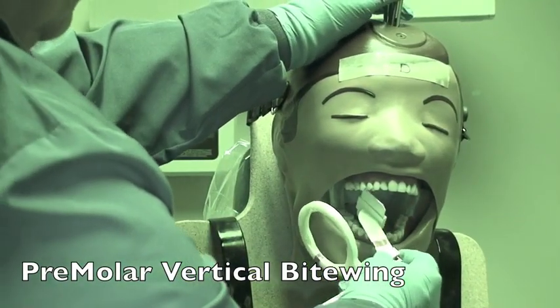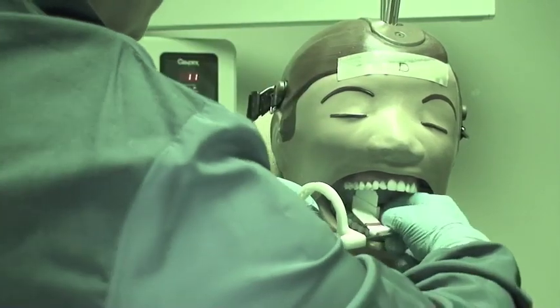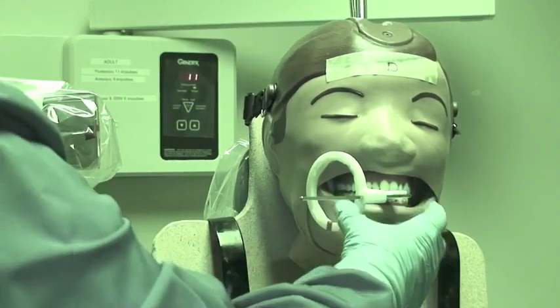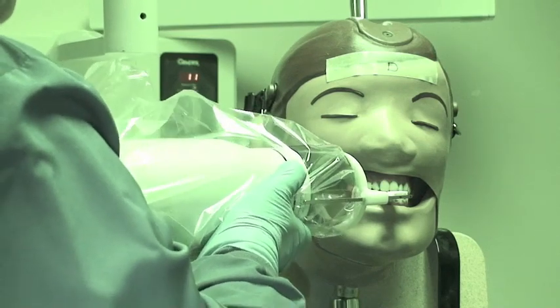To do the premolar view again, we're going to be able to get the six-year molar on the view. Go across the arch, then bring your wrist back to center the ring over the premolars. Then line up the PID to be parallel to the ring.